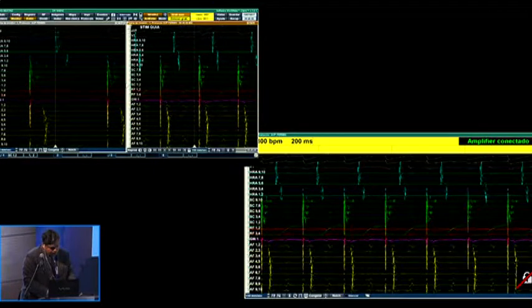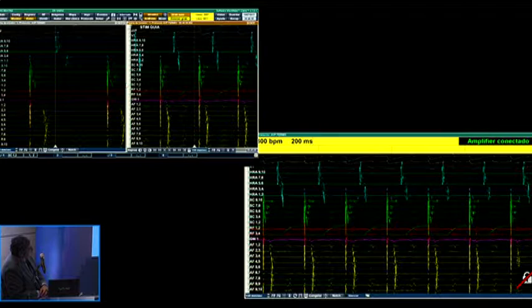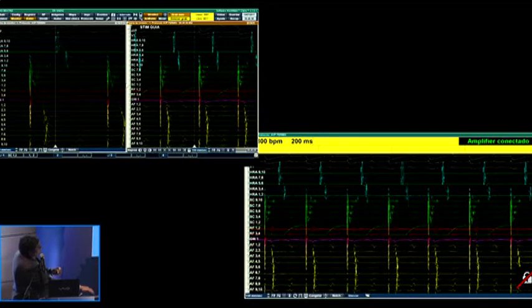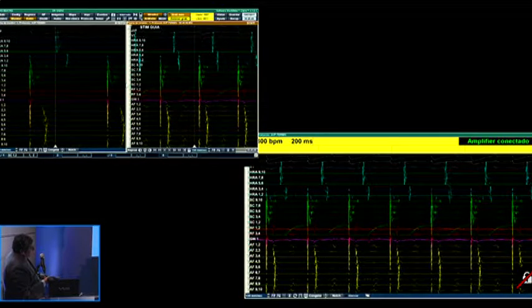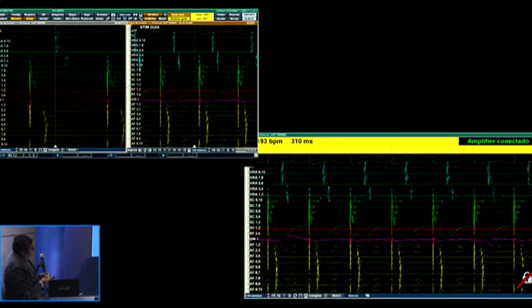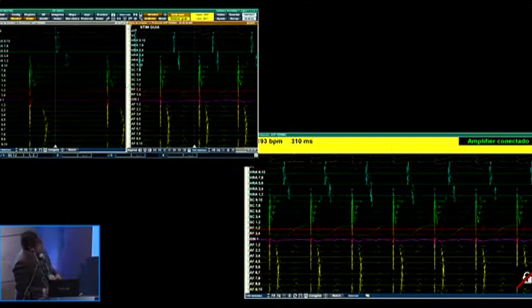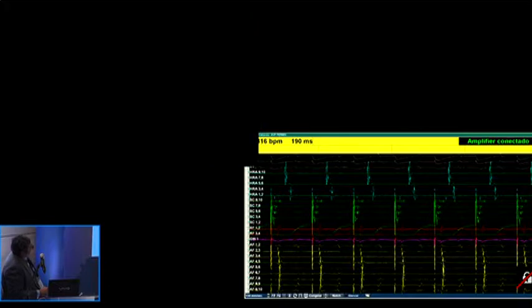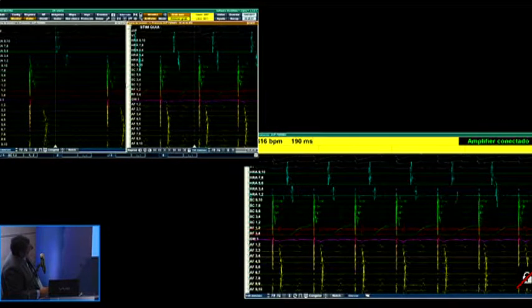Is it clear? Because this concept is very important. This is what we see in the electrogram. We are doing an activation, a pacing mapping of conduction through the isthmus of the line that we did before. And the Marshall's vein electrogram is earlier than the endocardium, despite the fact that it's further away. Yes, this is excellent.